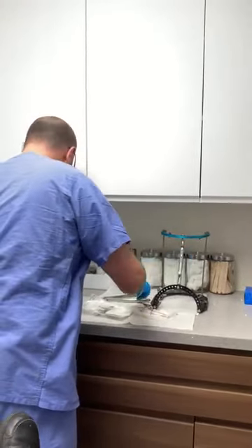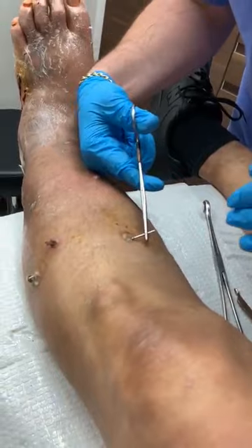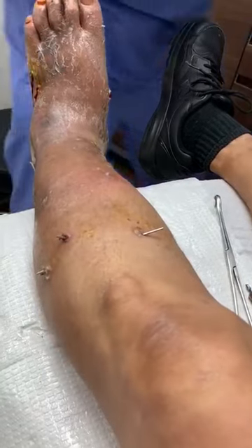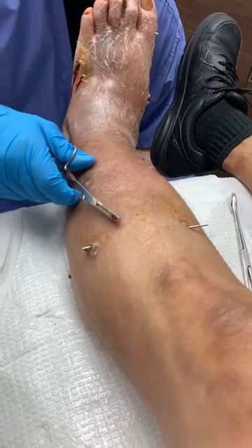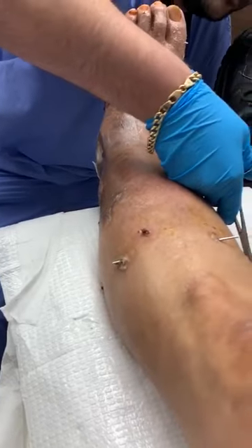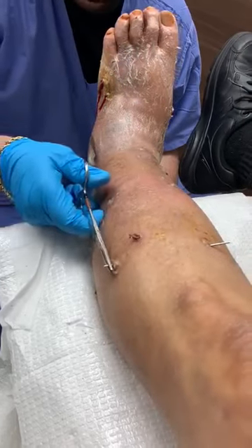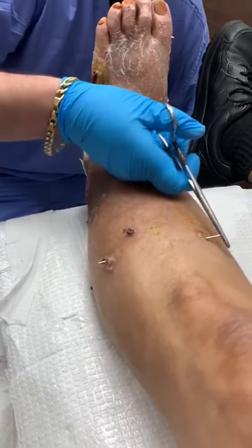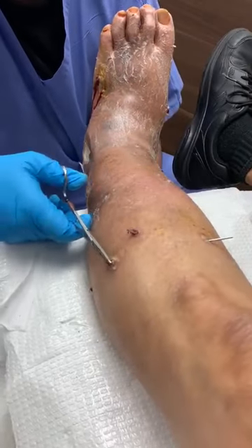That little delta frame will go over here. Pull these remaining olives out and we're done. These are smooth wires. Let me move them around a little bit more. I'm just trying to push them through a little bit.